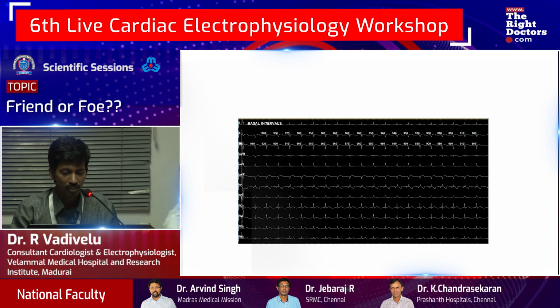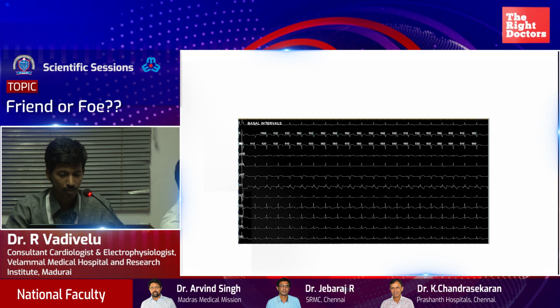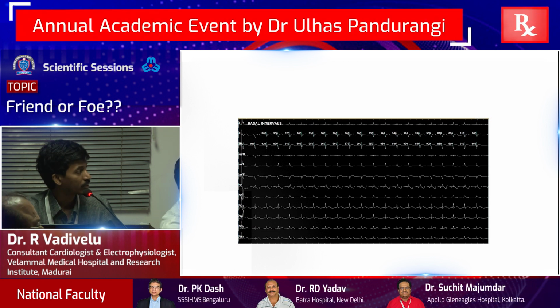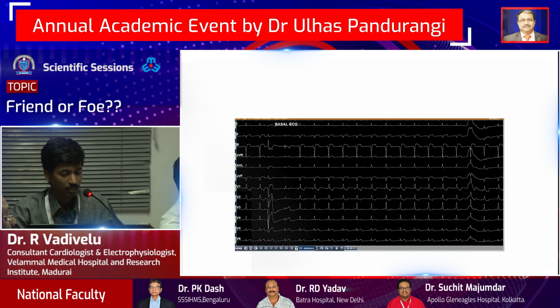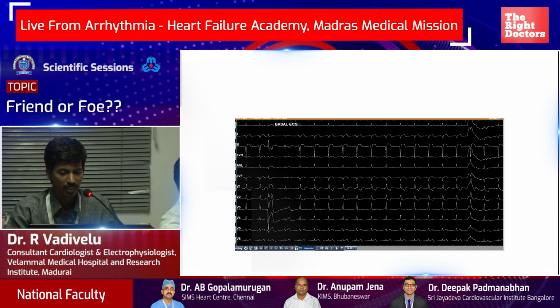This is the baseline ECG in the lab. So here now we are pretty much convinced that this is a left-sided posterior or posteroseptal pathway. Here is the baseline ECG. Again, this is a submaximal pre-excitation. The HV is not that short or that negative.